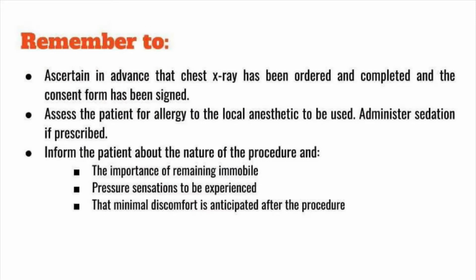Always remember to ascertain in advance that a chest x-ray has been ordered and completed and the consent form has been signed. Assess the patient for allergy to the local anesthetic to be used and administer sedation if prescribed. Inform the patient about the nature of the procedure and the importance of remaining immobile, pressure sensations to be experienced, and that minimal discomfort is anticipated after the procedure.